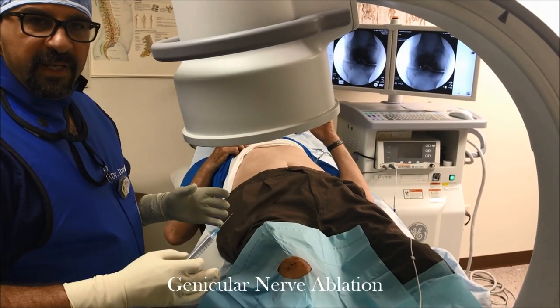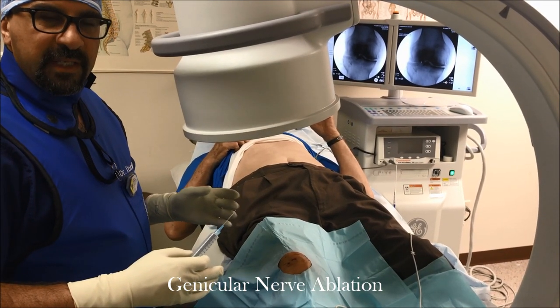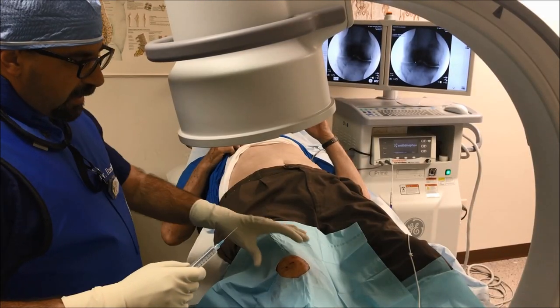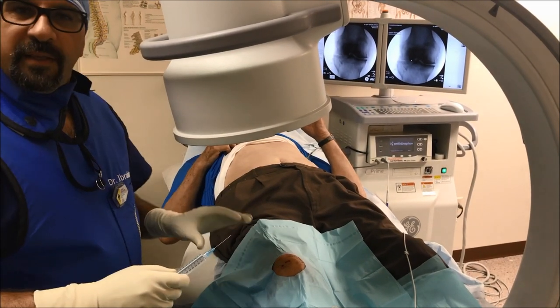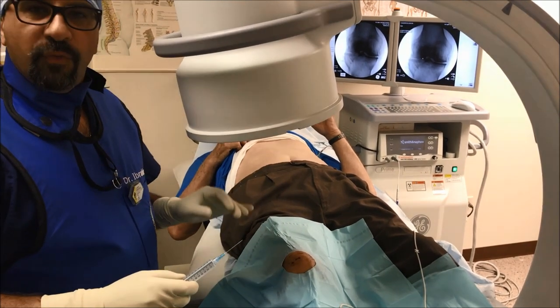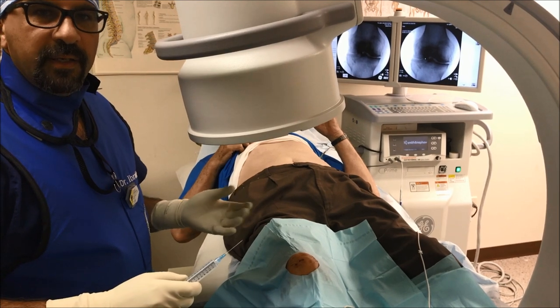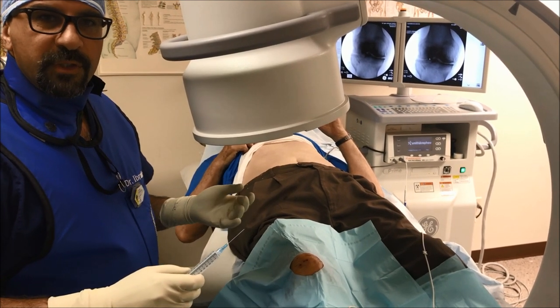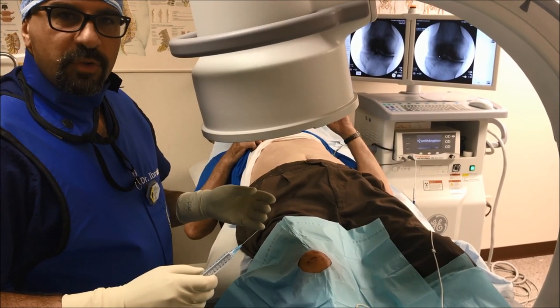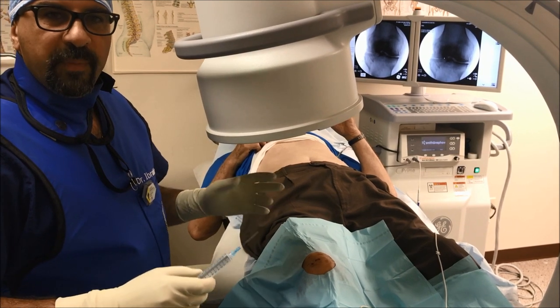This procedure is to address severe knee pain secondary to osteoarthritis. The patient is not fit and is not a candidate for total knee replacement, so we are trying to help him by performing genicular nerve radiofrequency ablation, which cauterizes the three major nerves supplying the knee.